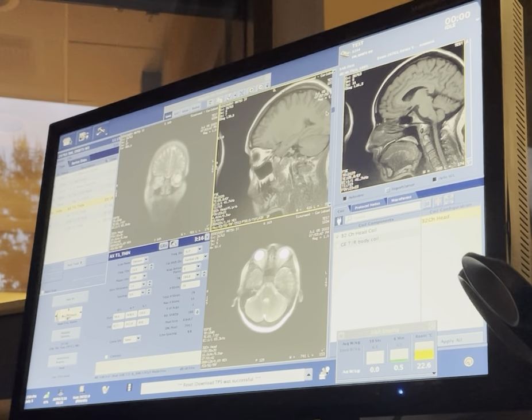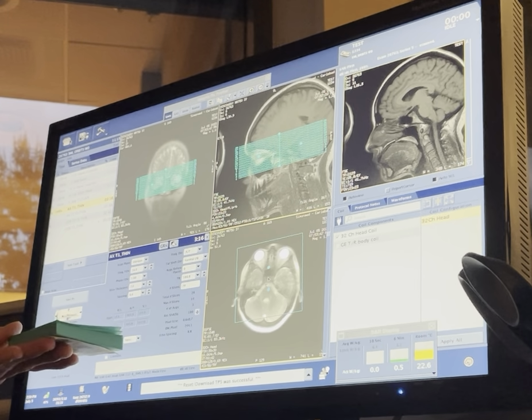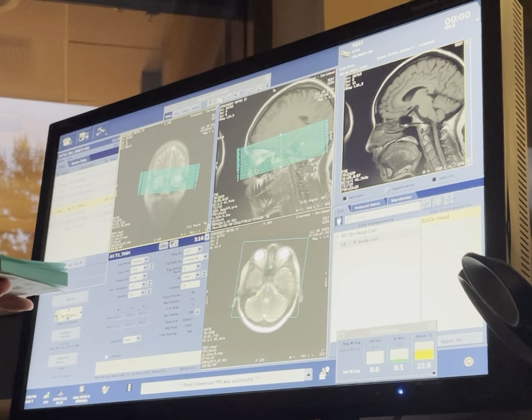So we're gonna drop our slices. So if we're looking top down, it's gonna look like that. So let's drop that and let's rotate it. You always handle your box first, perfect. And now let's angle it in our coronal plane up here. Okay, that looks good. Now I'm gonna have you angle it with the optic nerve in that one.